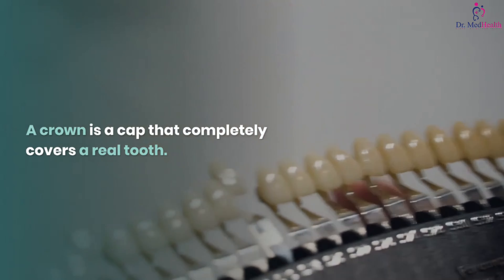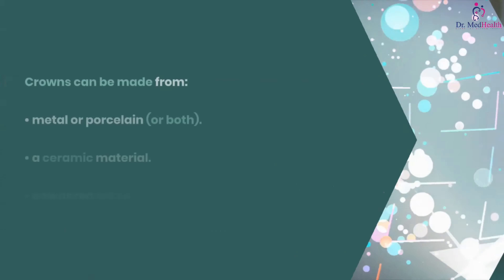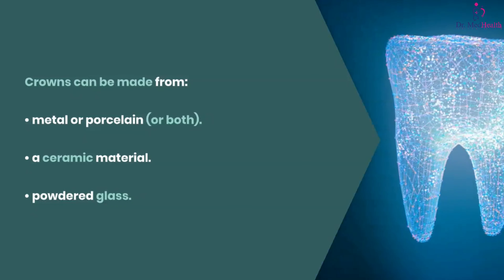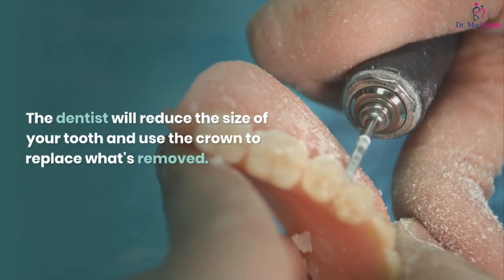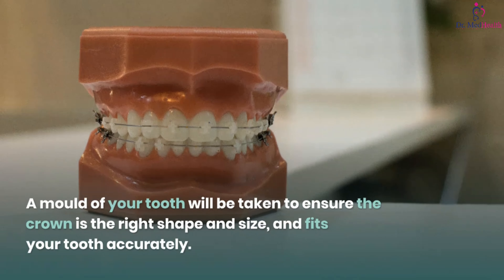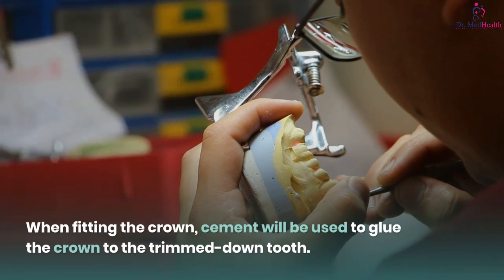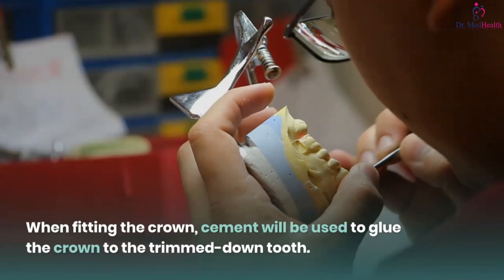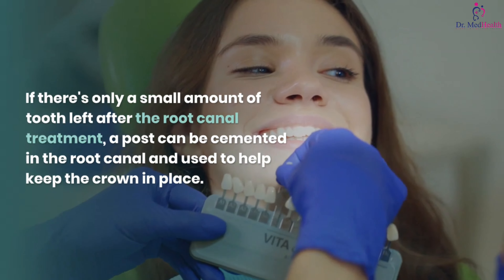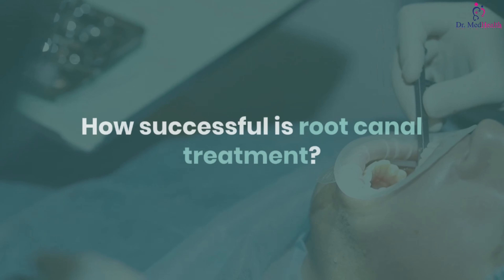Adding a Crown. A crown is a cap that completely covers a real tooth. It might be necessary to use a crown after root canal treatment to prevent the tooth fracturing. Crowns can be made from metal or porcelain, or both, a ceramic material made from powdered glass. The dentist will reduce the size of your tooth and use the crown to replace what's removed. A mold of your tooth will be taken to ensure the crown is the right shape and size and fits your tooth accurately. When fitting the crown, cement will be used to glue the crown to the trimmed down tooth. If there's only a small amount of tooth left after the root canal treatment, a post can be cemented in the root canal and used to help keep the crown in place.